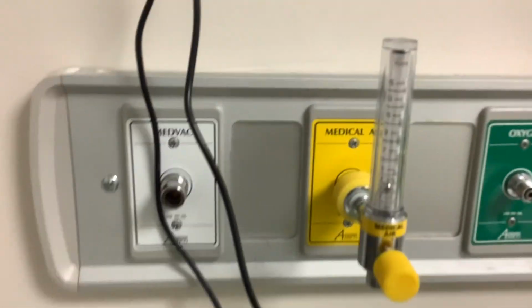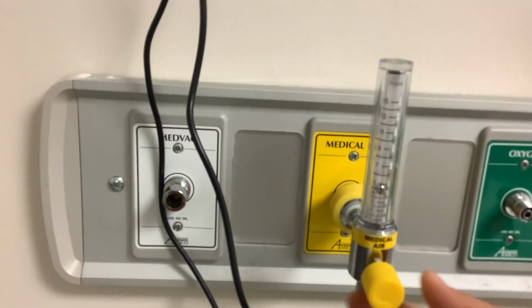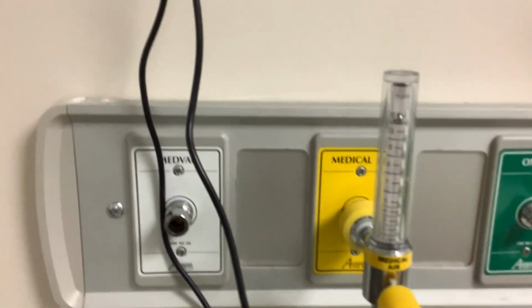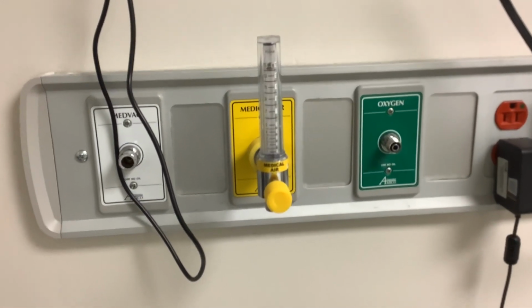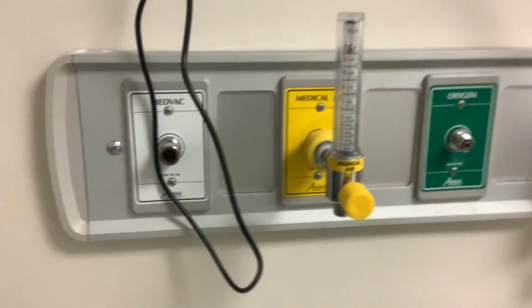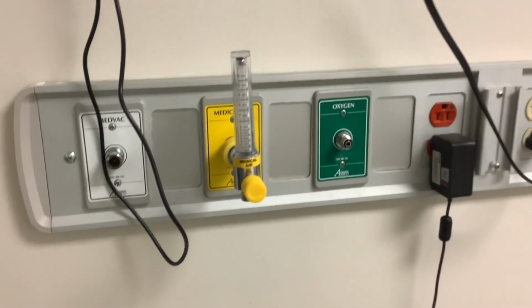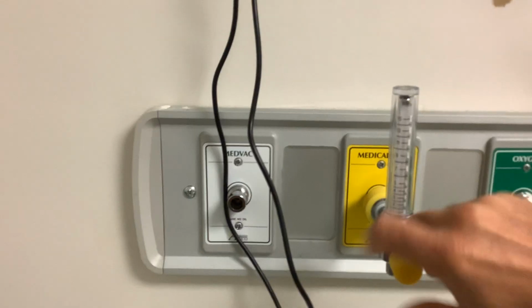This flow meter is calibrated to provide a liter flow of up to 15 liters per minute. So I'm going to turn it up to 15 and let you hear that. Now, if this is up to 15 liters per minute, is that flow meter capable of delivering more flow than 15 liters per minute? It's only calibrated for you to measure that, but yes, it certainly can deliver more flow than 15 liters per minute. So if I were to turn this up, that's what you hear coming from the flow meter.